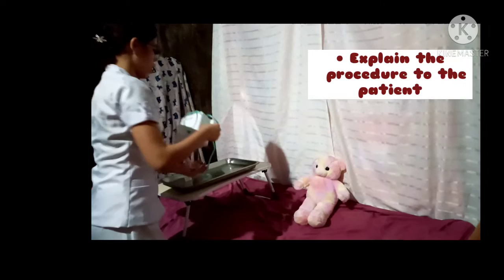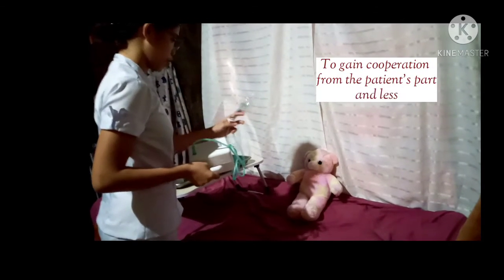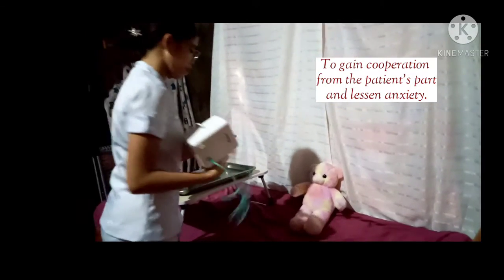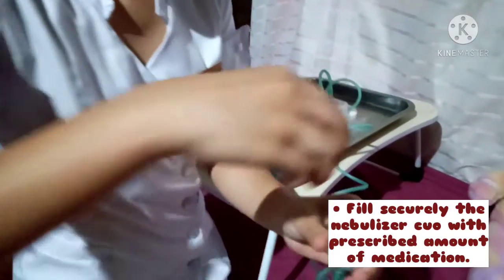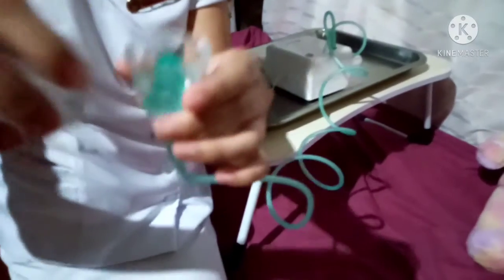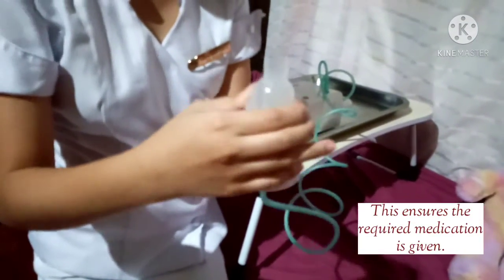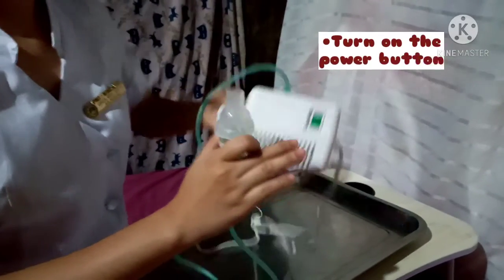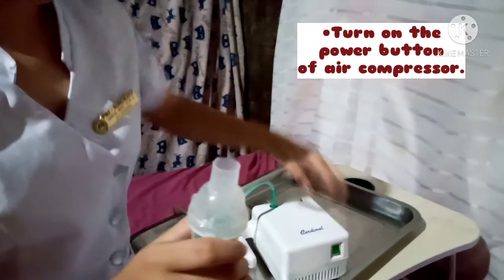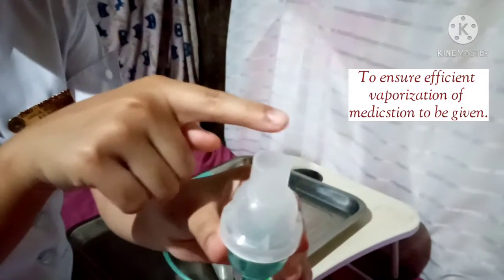Explain the procedure to the patient. This helps to gain cooperation from the patient's part and to lessen anxiety, thereby promoting effectiveness of therapy. Fill securely the nebulizer cup with the prescribed amount of medication. This ensures that the required medication is exactly given. Turn on the power button of the air compressor. This ensures the efficient vaporization of the medication to be given.